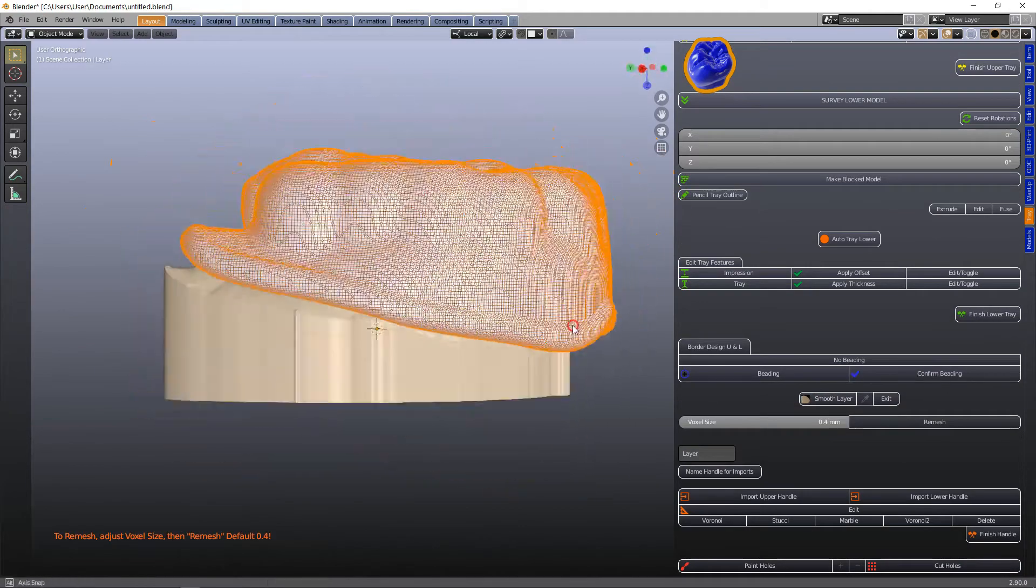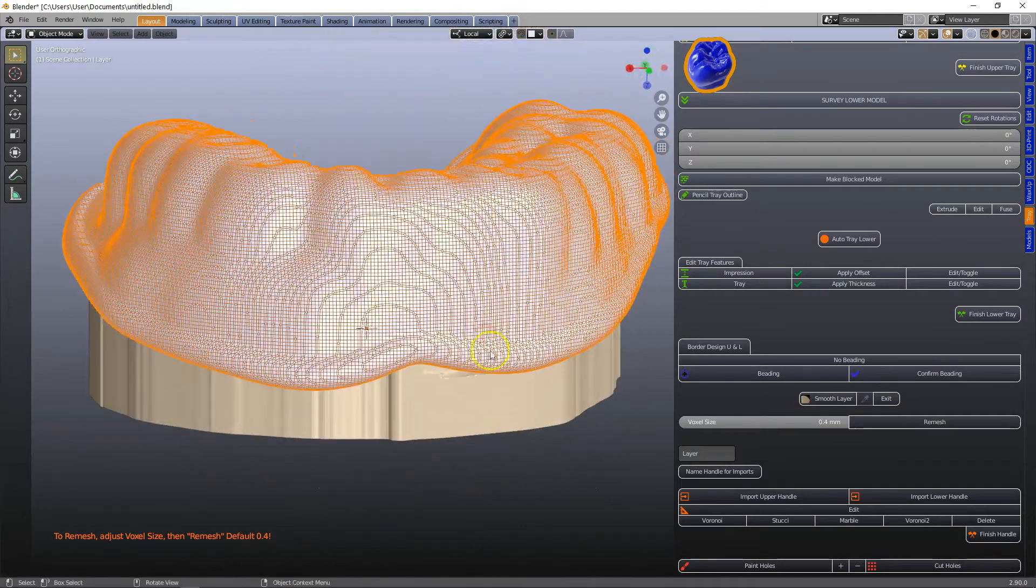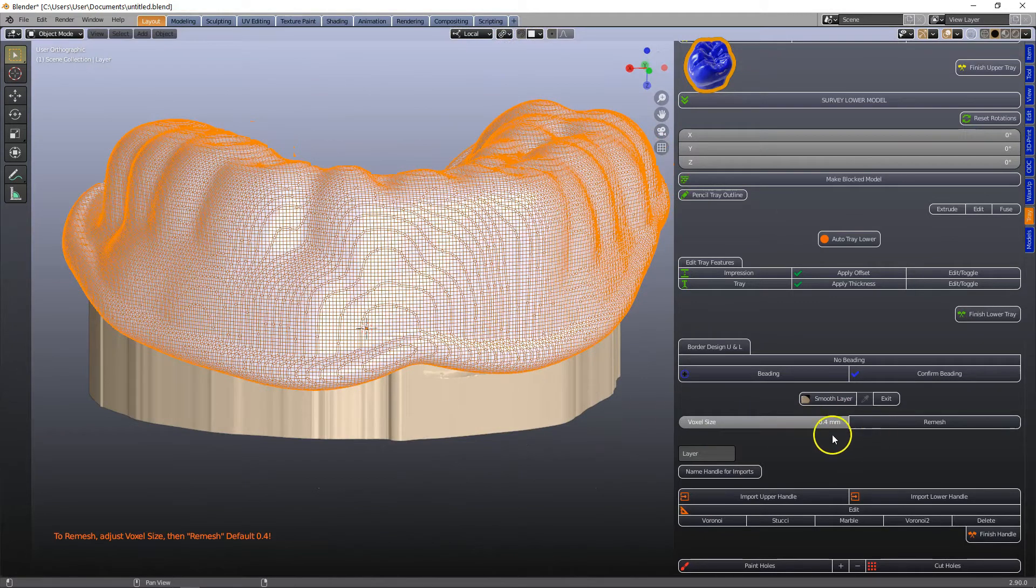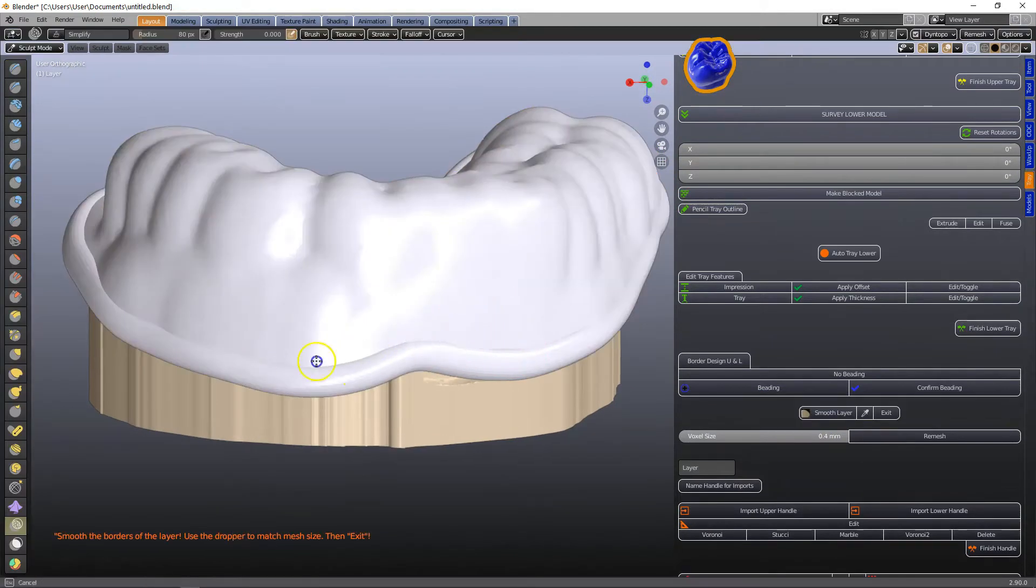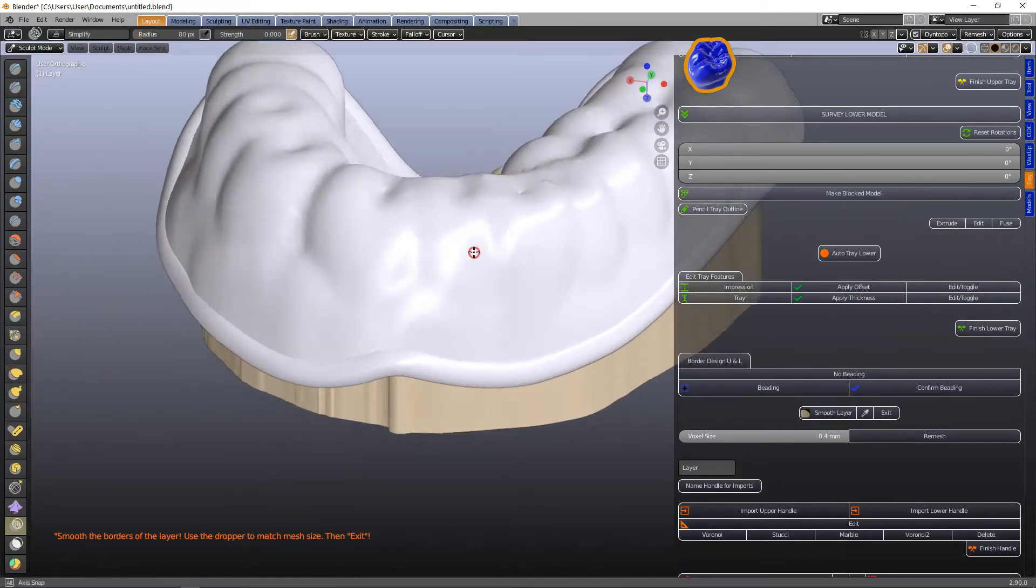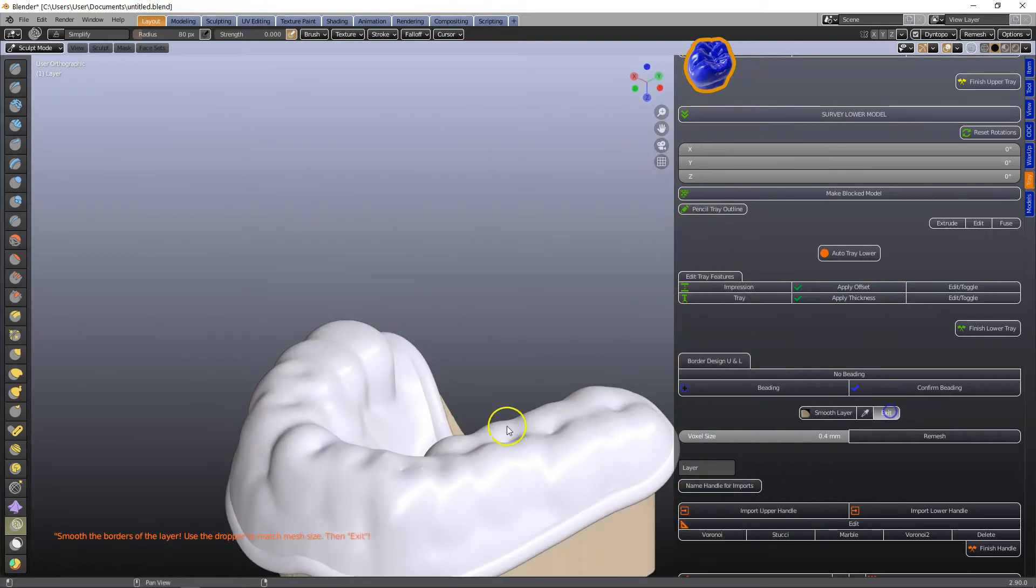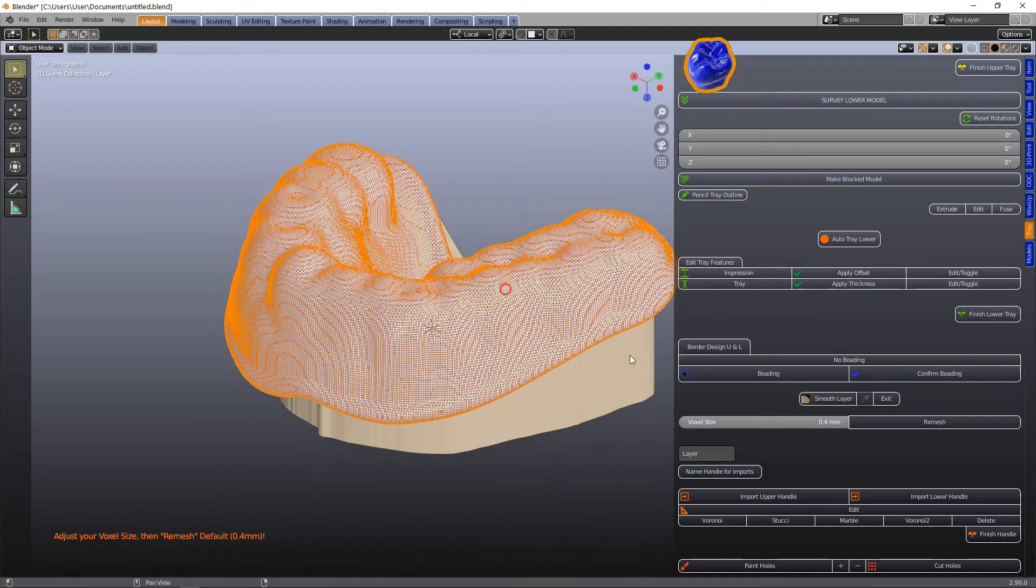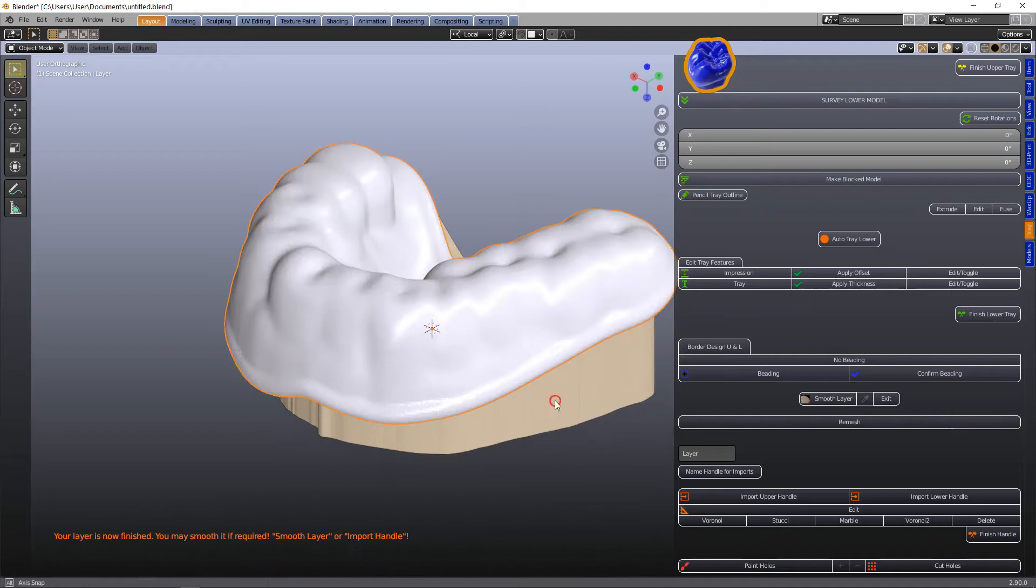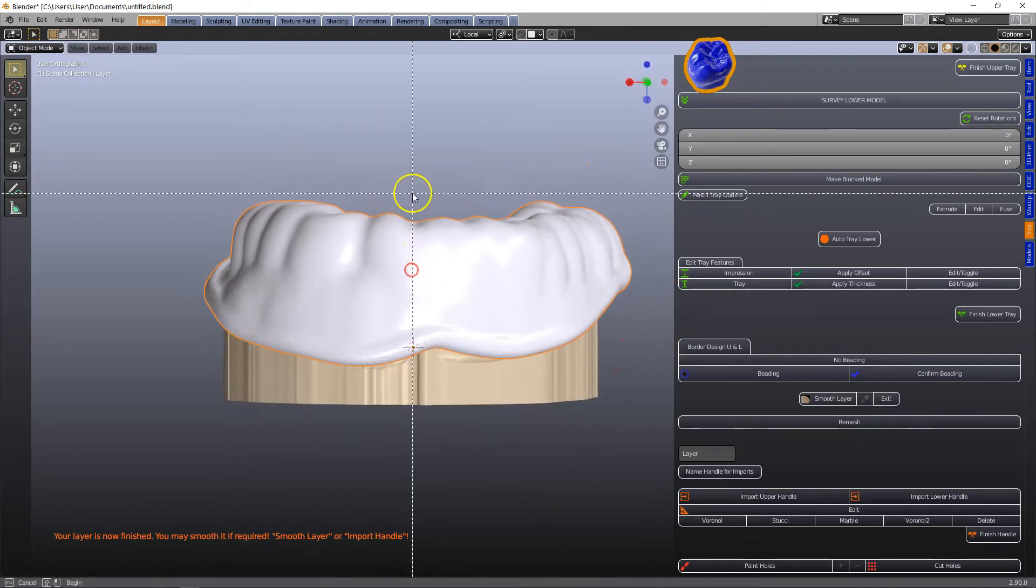Then we're going to click on confirm beading and this will put us into mesh voxel mesh and we can remesh it and we can sculpt it if we want to and then exit. This is a voxel remesh and click on remesh.